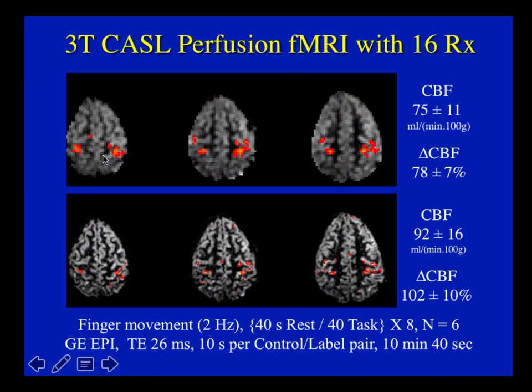Here's an example of motor activation, bilateral motor finger tapping. We see the location of the active sites on both hemispheres.